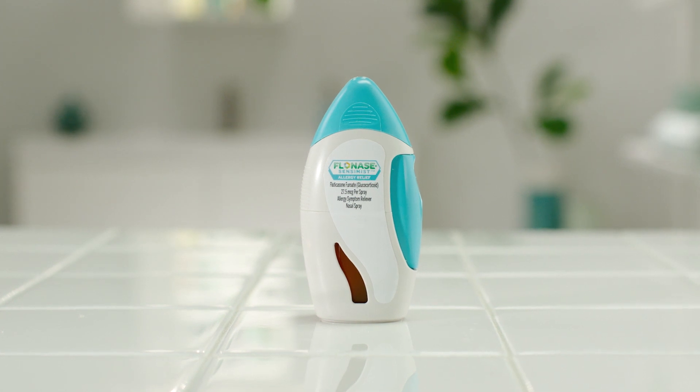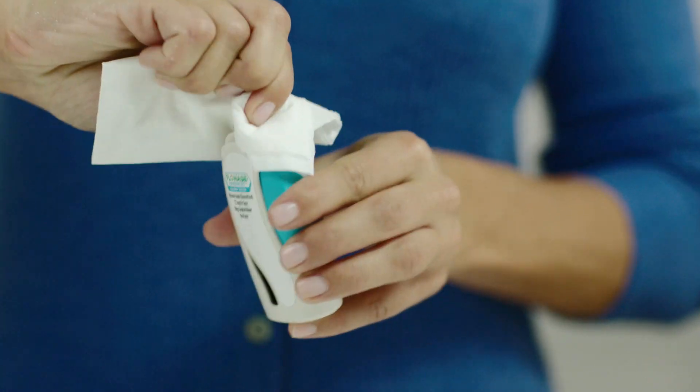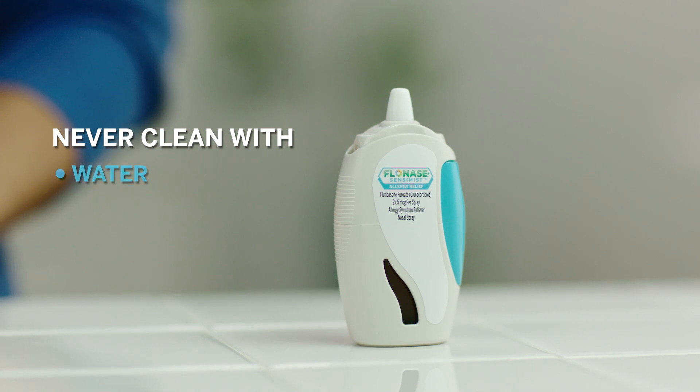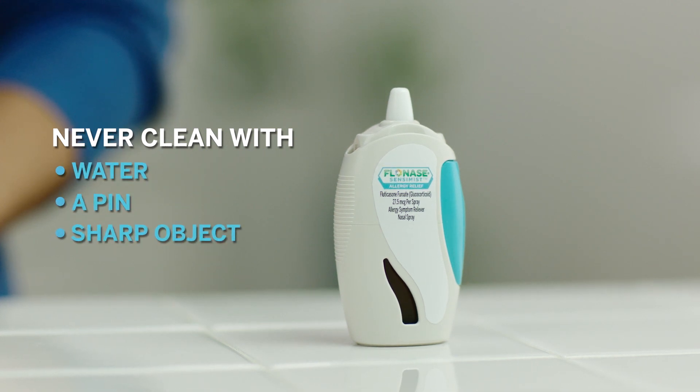Keeping a clean spray nozzle helps to ensure a full dose. Every time you finish using Flonase Sensimist, be sure to wipe the nozzle with a clean, dry tissue. Never try to clean the nozzle with water, a pin, or a sharp object. This will damage the nozzle.